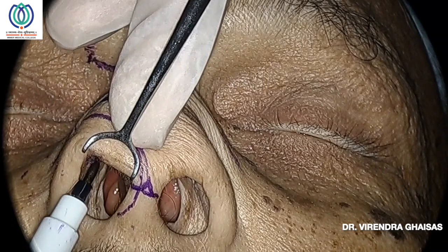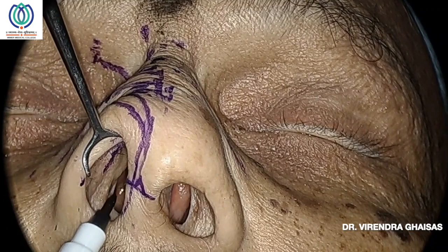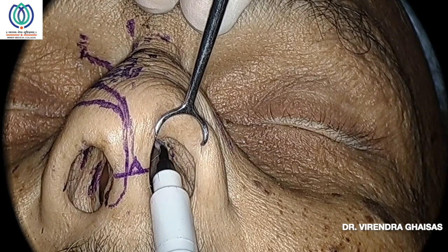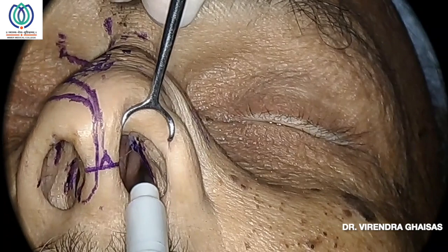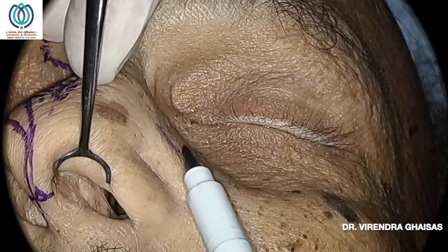Then this is a 3 millimeter incision, which is 3 millimeters inside the rim, as the lower lateral cartilage, the medial crura, is very close to the rim medially. Then you can see the lower border of the upper lateral cartilage, where you can take an incision for the closed rhinoplasty approach. You can combine this with a transfixation or a septoplasty Freer's incision, and you can easily do a closed rhinoplasty by this approach.